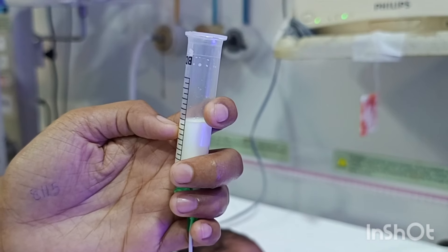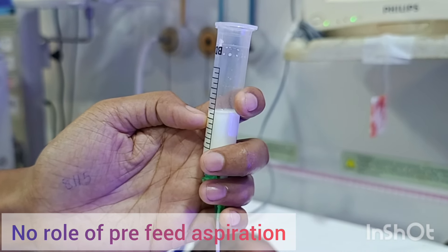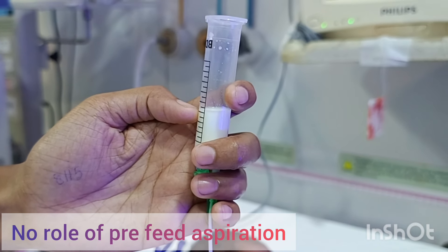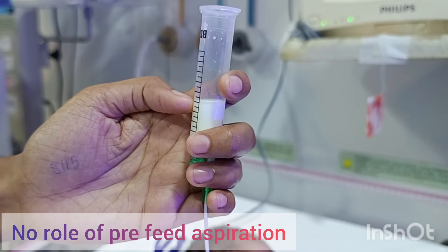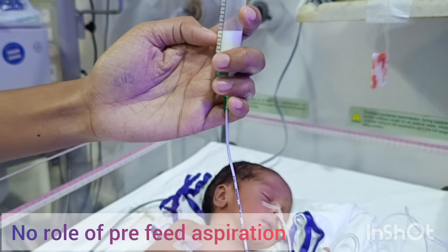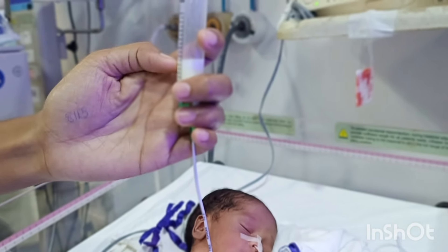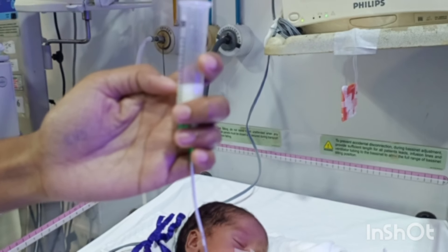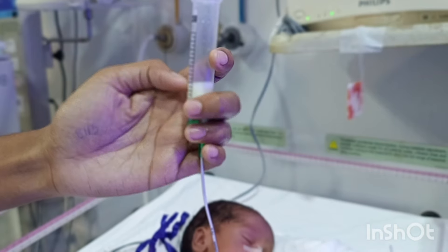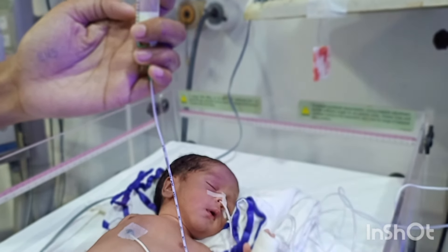In the modern technique, we do not aspirate any milk from the baby before starting the feed, because it has been shown to cause injury to the gastric mucosa. So there is no role of aspiration before starting a feed. If you are not sure whether the baby has digested the milk properly, measuring the abdominal girth can be a useful monitoring method. Do not aspirate any milk, as it can cause gastric injury and bleeding.